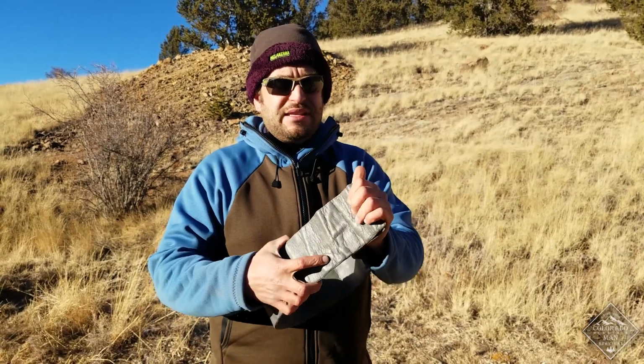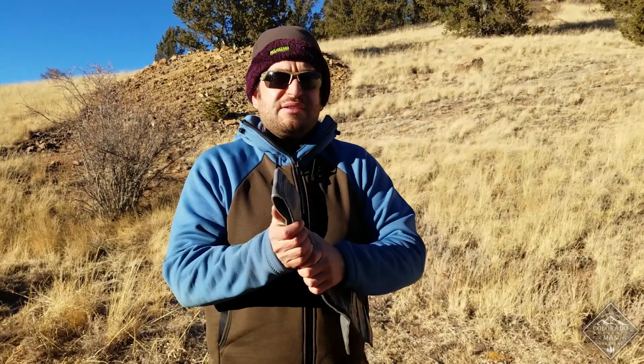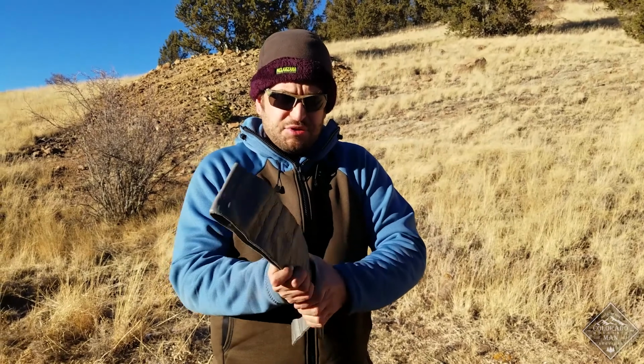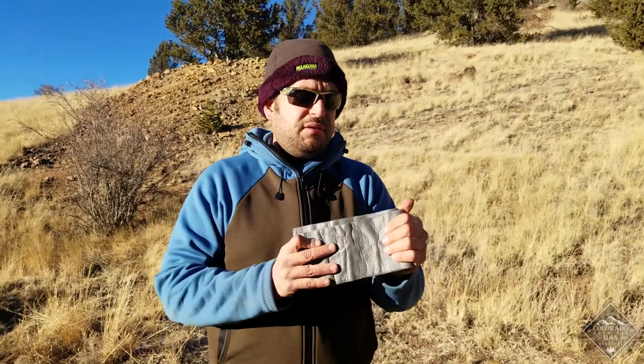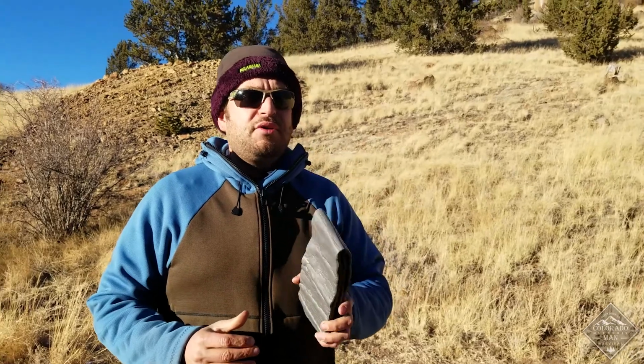The reason that I like these SAM splints so much is because you can use them for a lot of stuff. A commercial C-collar costs about 50 bucks. Usually you have to get a prescription, although, you know, you can get stuff on Amazon, and you can only use it for that cervical collar. With this, you can immobilize pretty much anything. I recommend carrying at least 2 or 3 of these in your kit.